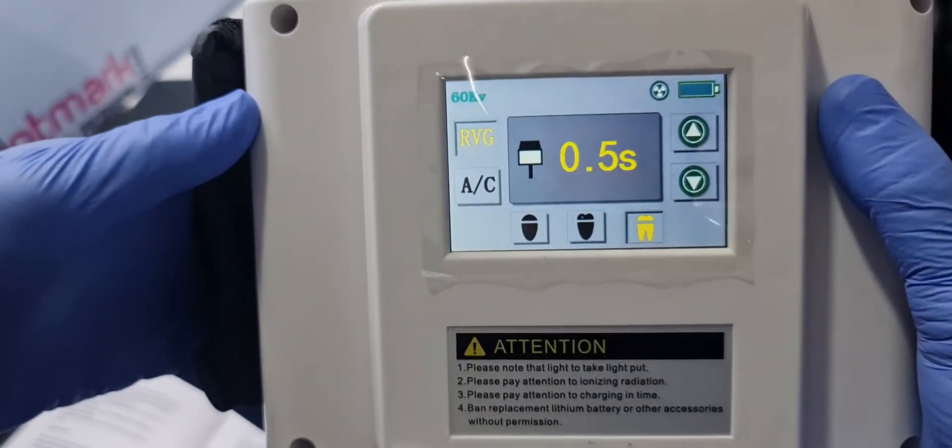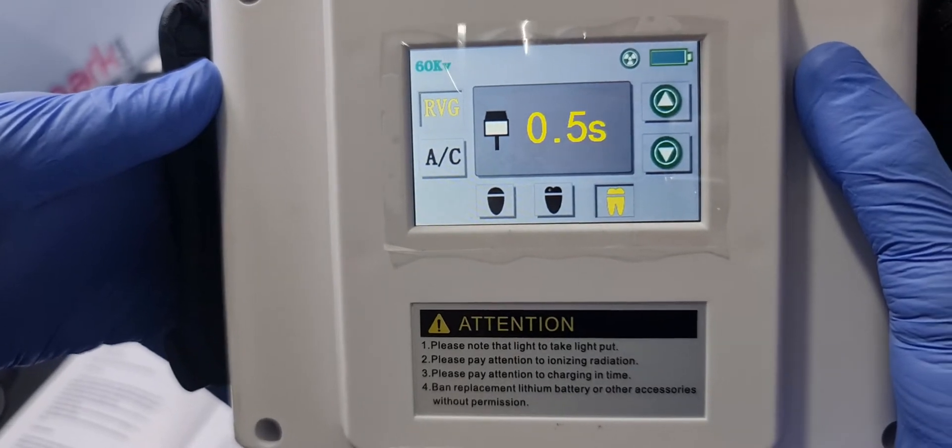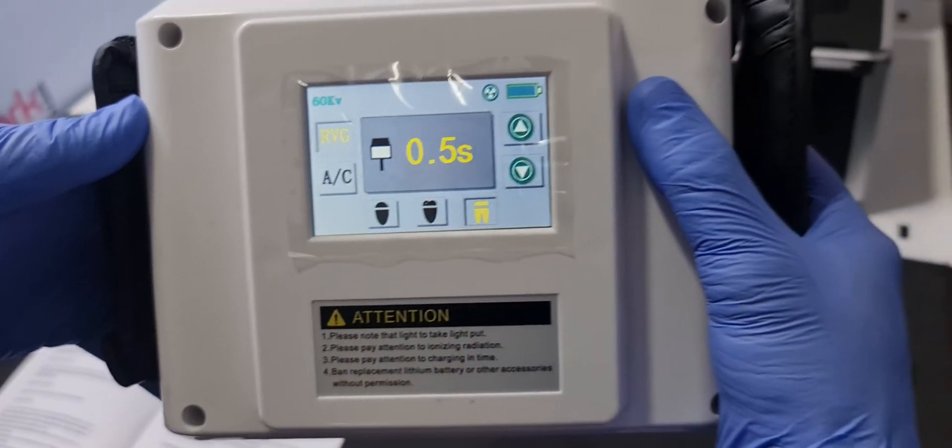It has a tube voltage of 60 kV, an operating frequency of 20 kHz, and a tube current of 1 mA.